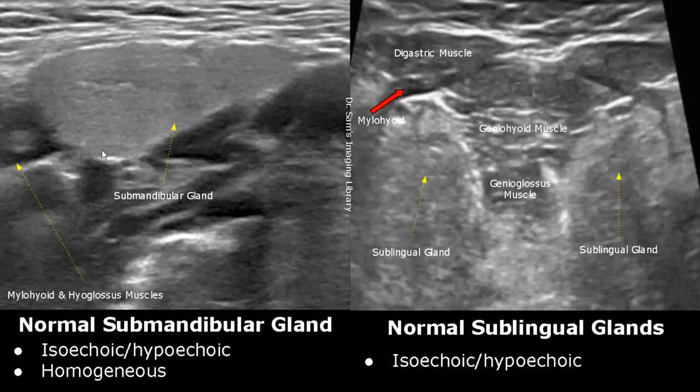On the right side, we have the normal sublingual glands. We can see both of them in this image, as it is a transverse view. They can be isoechoic or hypoechoic to adjacent structures.